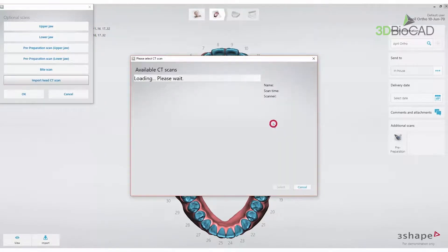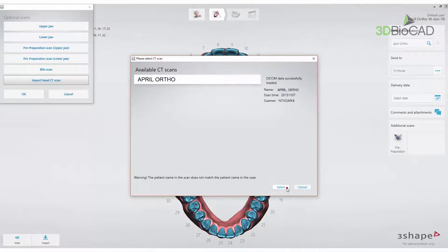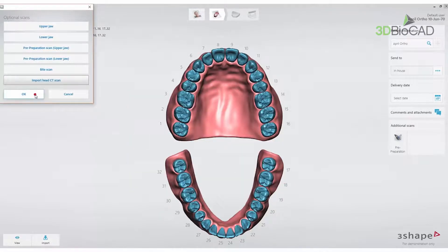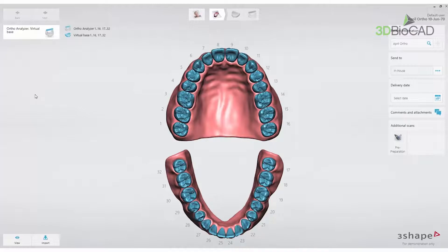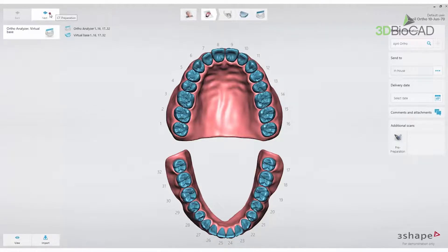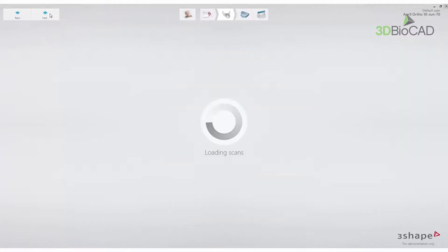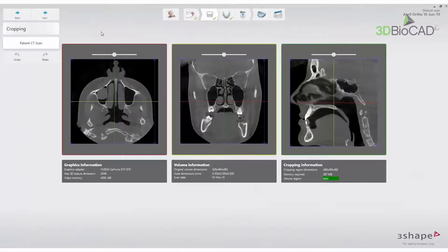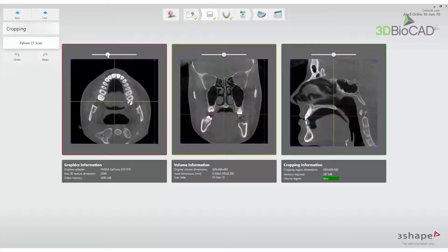When a case includes a CBCT Scan, the CT Preparation step will automatically be placed in the workflow bar. Press Next. The alignment of the intraoral scan and CBCT Scan starts with the cropping step, where you can reduce the CBCT Scan to a suitable size for OrthoAnalyser.